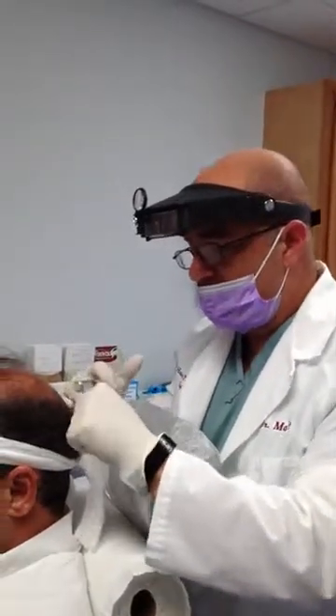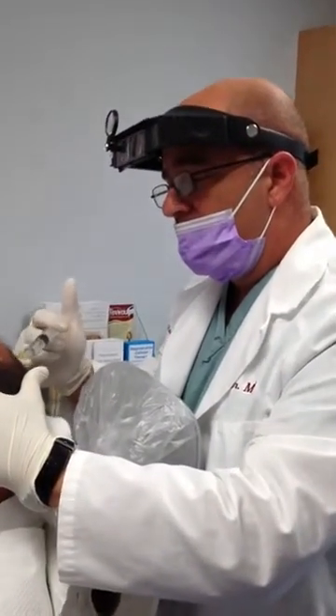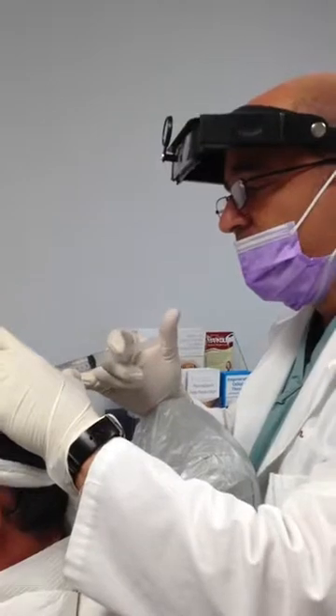Okay, Petro, we're going to check your anesthesia and make sure everything is numb. Tell me if you still feel anything at all other than pressure. Just a little bit of pressure. What I've done is I've just done a ring block on Petro with local anesthesia, lidocaine.